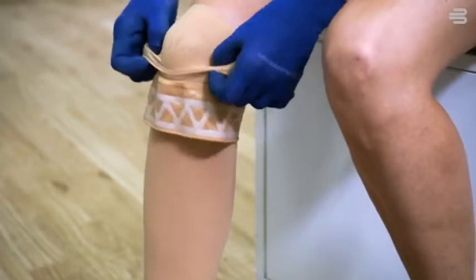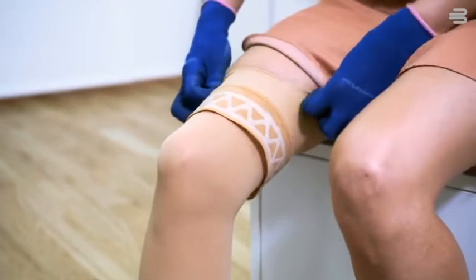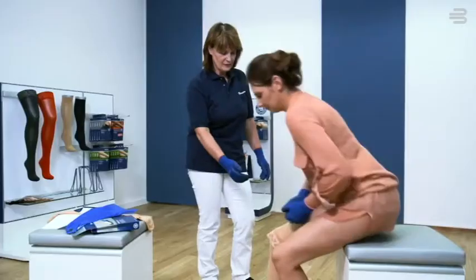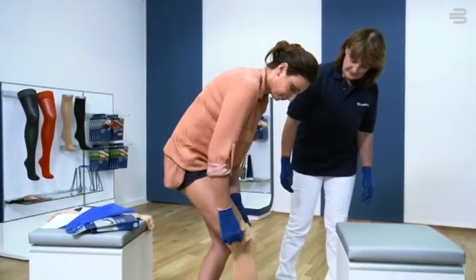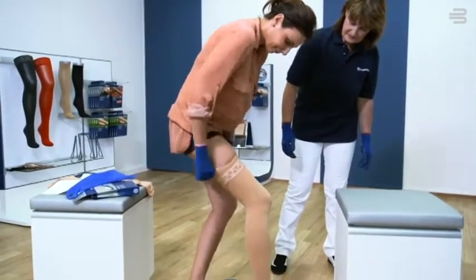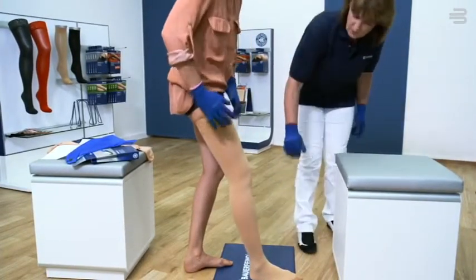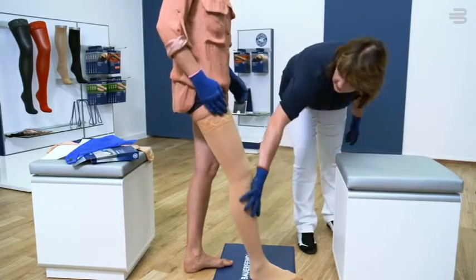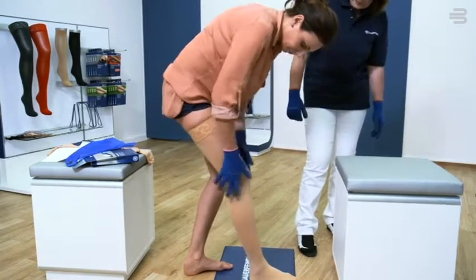An important tip: when putting on stockings, it's the technique that matters, not how hard you pull. Finally, turn over the top band. Wearing the gloves, you can now make the final adjustments to the knit.